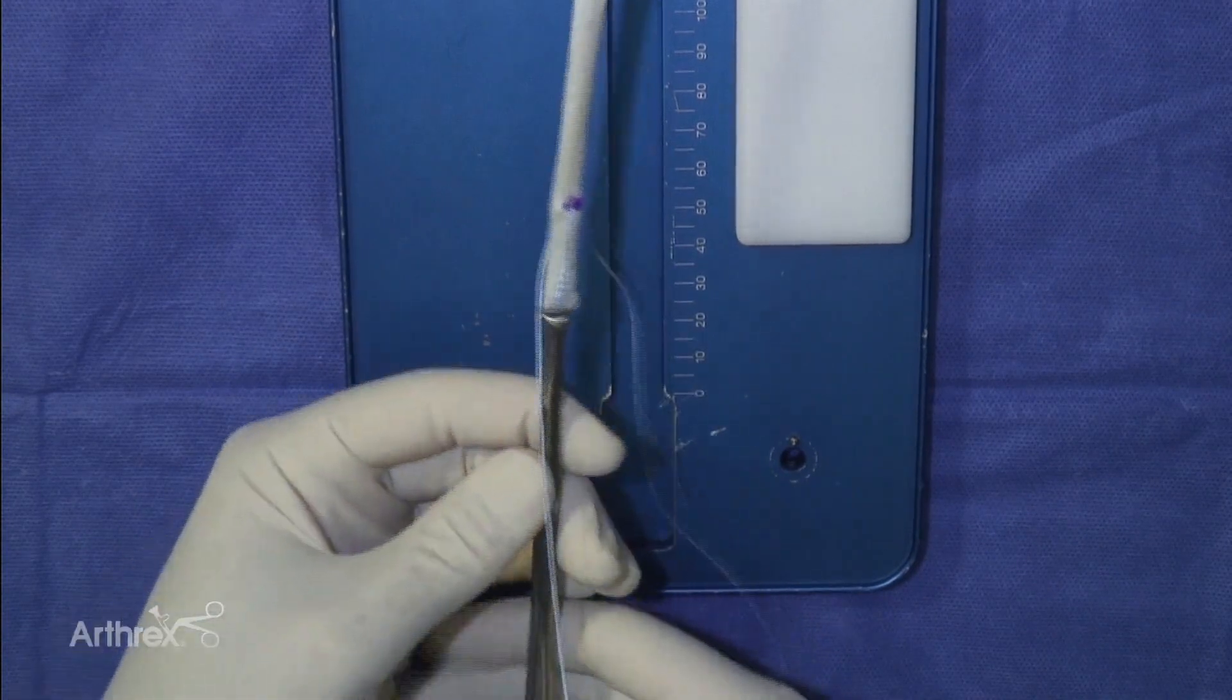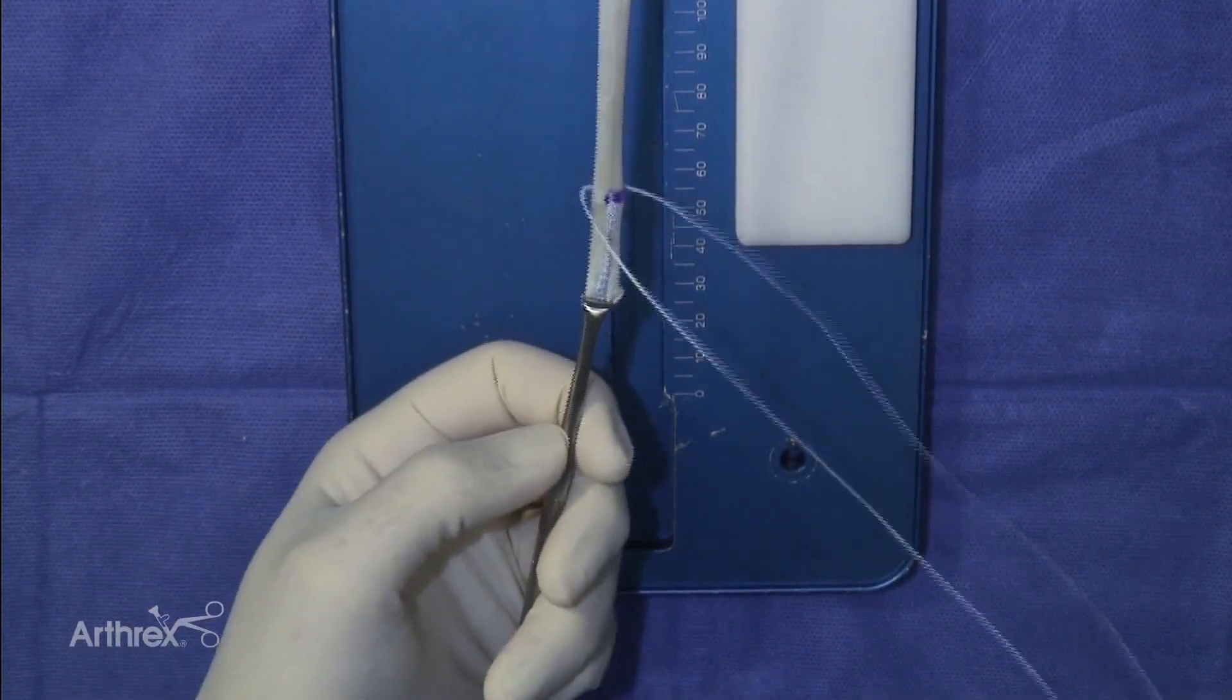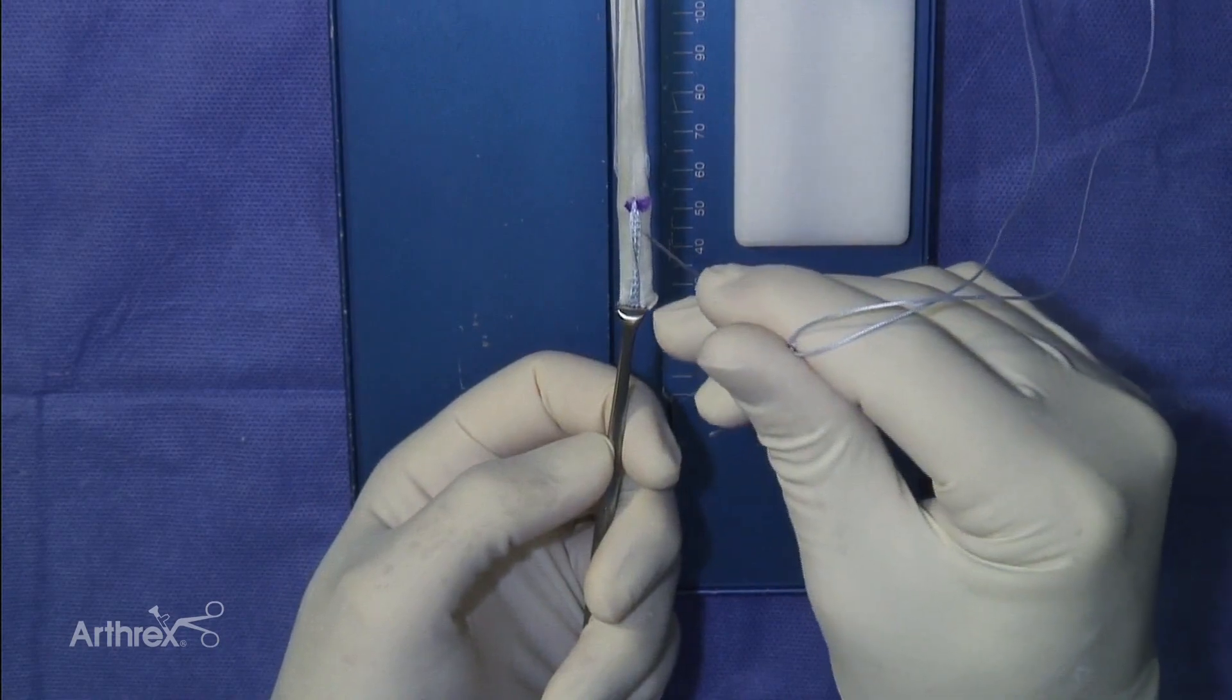Spread out the limbs of the fiber loop and pass the graft through the middle of the loop. Pull the suture proximally to facilitate passage of the needle.